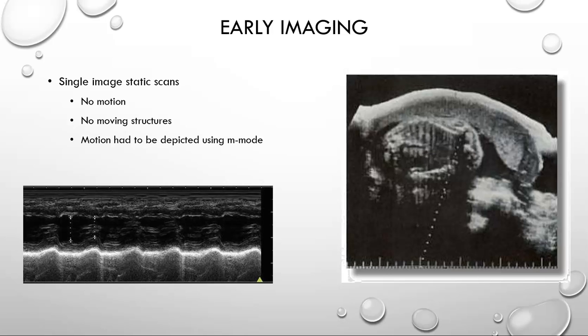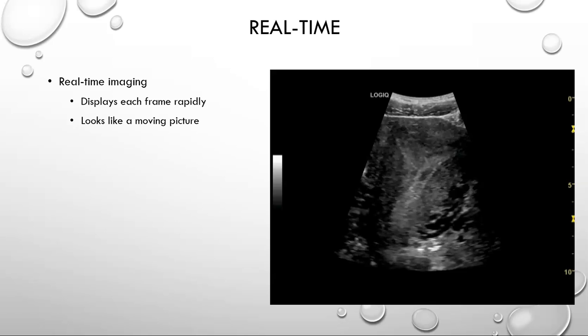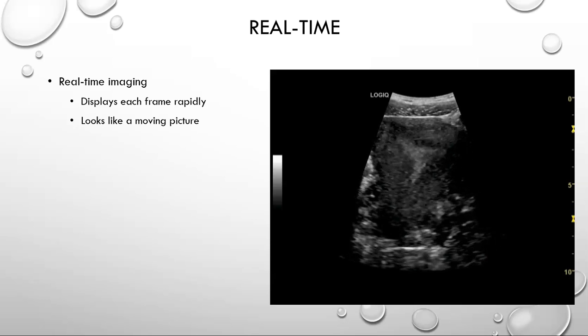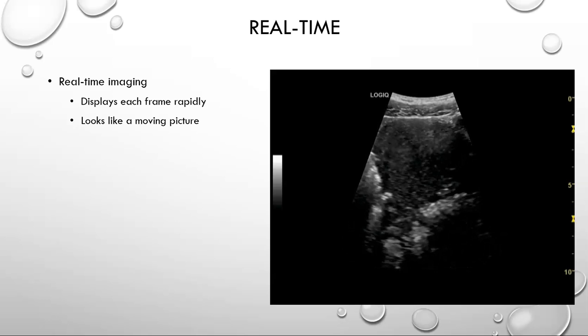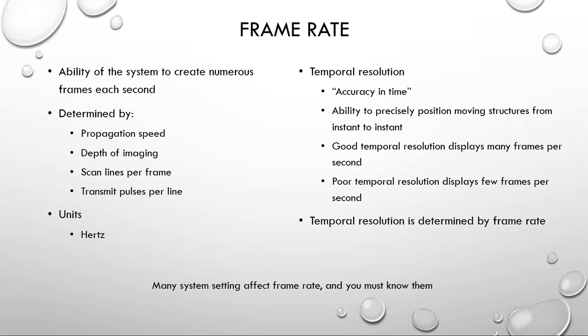Of course, today we have real-time scanning, which allows us to see structures as we're sweeping through them. So it's a lot different. Everything looks like more of a moving picture as you're scanning. Of course, once you freeze the image, they look very similar.